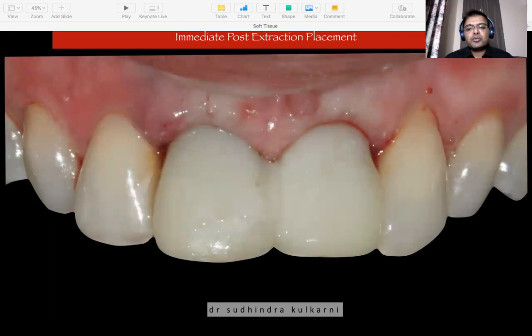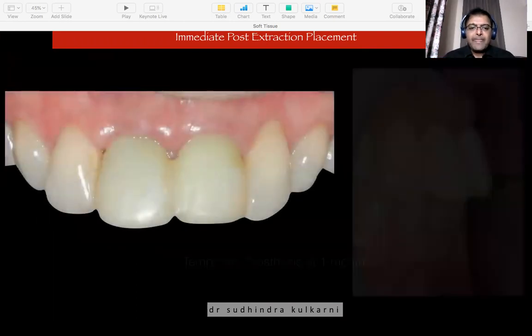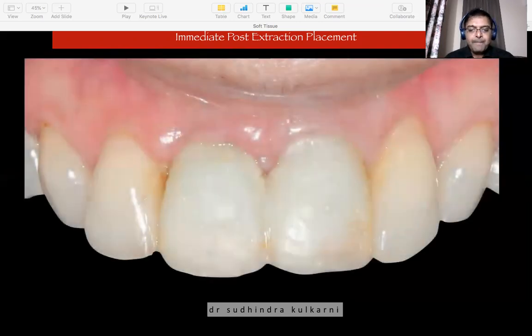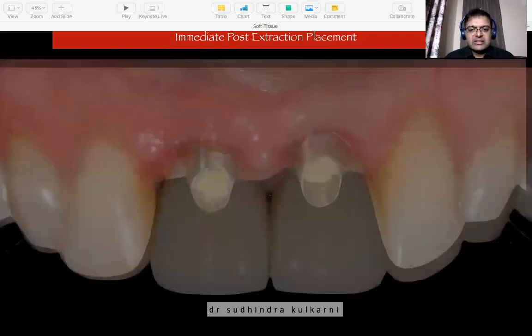Because every time you put an immediate temporary on those implants, you guard the soft tissue. Because the soft tissue gets supported at the top by this temporary. And that's what you see when the patient comes back at the end of 1 month after the implant. You see the soft tissue looks good. There's a beautiful papilla that is still there. At 3 months, it looks nice.